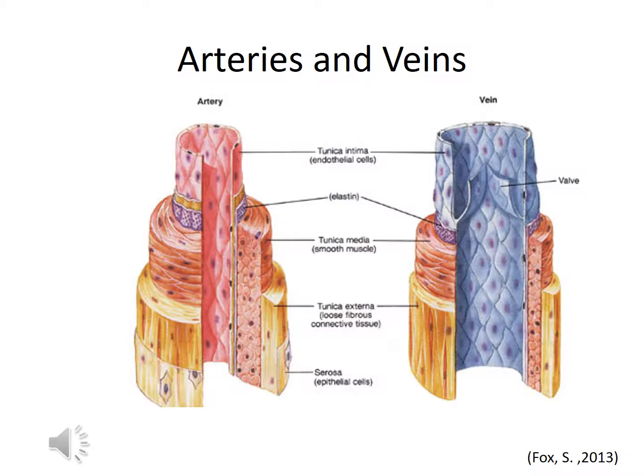So you'll notice when you have to put an IV catheter in a vein, you have to introduce it into all these 3 different layers. The initial layer, you'll feel a puncture. The final, once you enter the vein, you'll feel a pop, and you're popping through all those elastic layers.